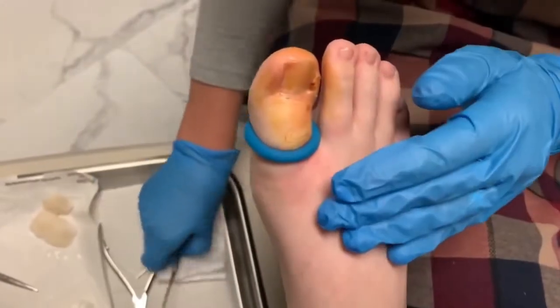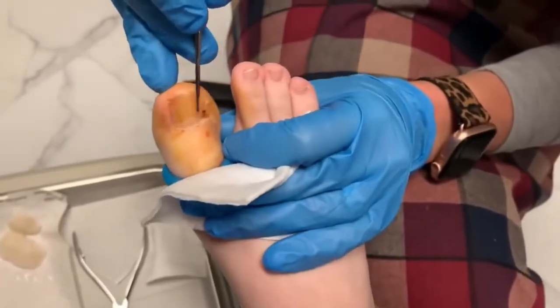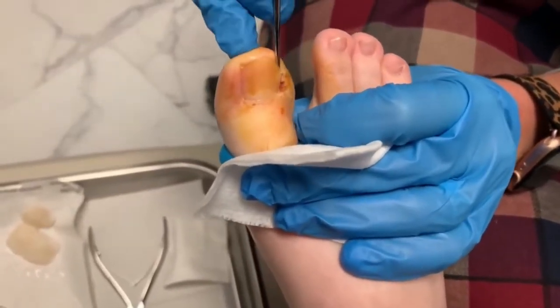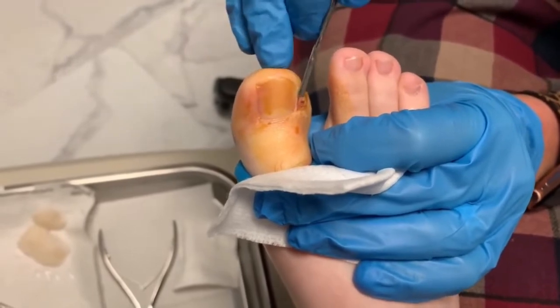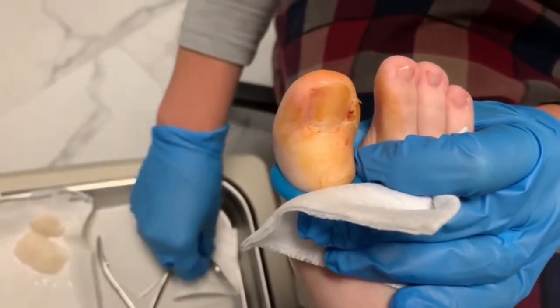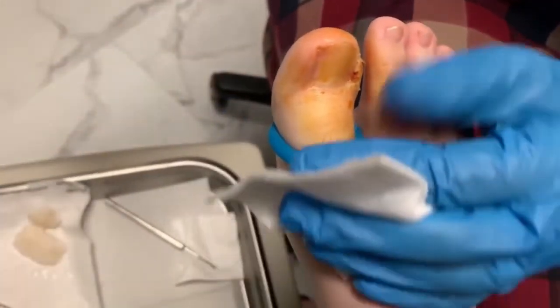Let's get started — get that little nail out. First I'm just going to free up the nail. There may be some pus that comes out. And you can see actually where the infection was tunneling here.